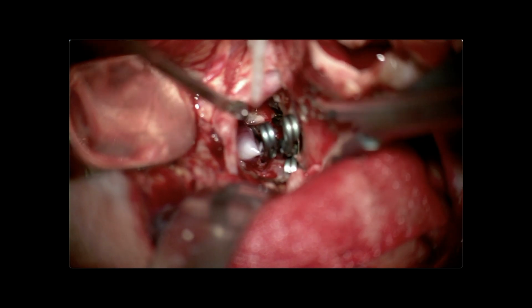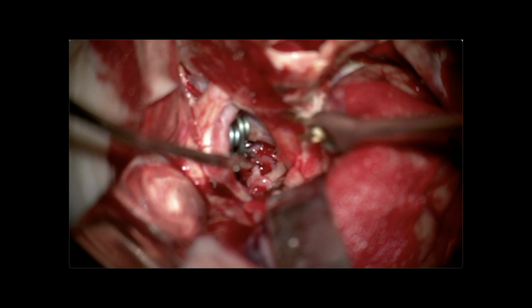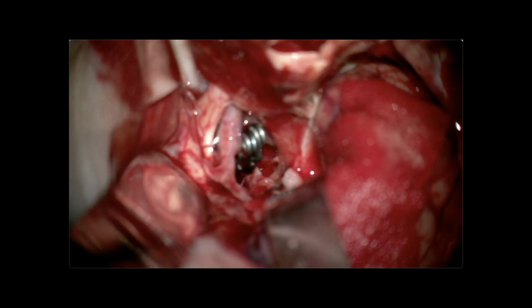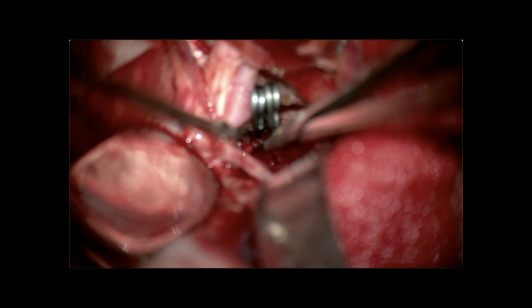Next, temporary clips are removed from the trunk of the basilar artery, and blood flow is restored. The total time of temporary clipping in this situation did not exceed 4 minutes. Additional dissection of thalamoperforating arteries is carried out.